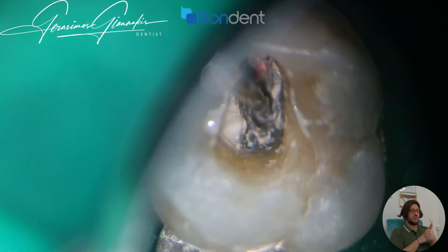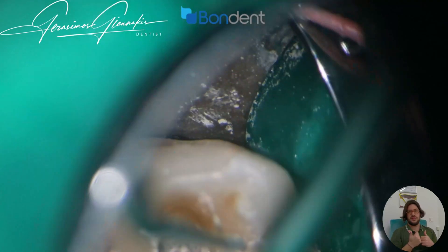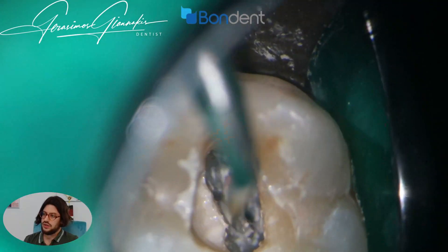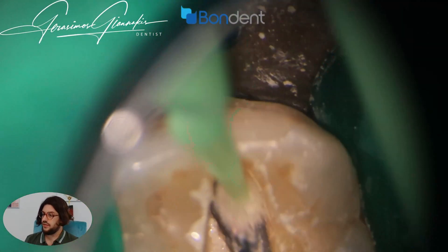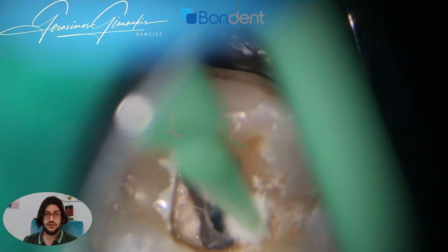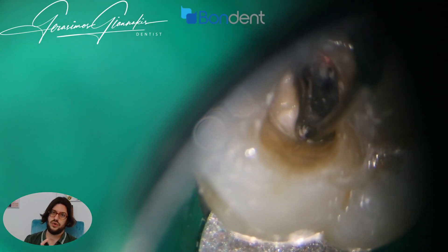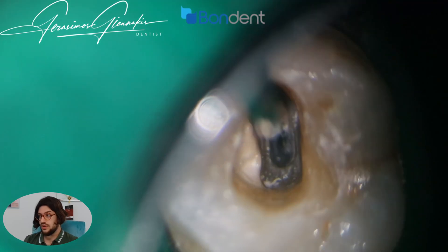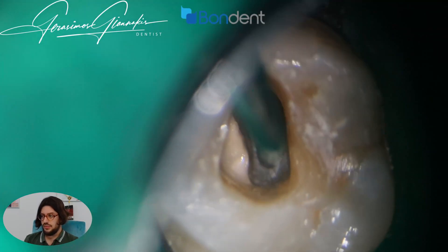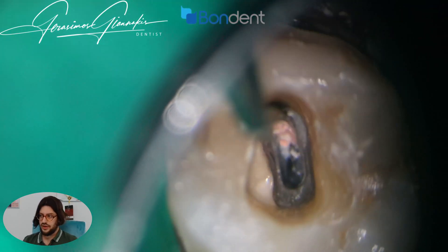Let's sum it up. First, evaluate the case from radiographic evaluation — periapical or CBCT. Then plan how to instrument such cases: do coronal enlargement on the orifices of the deep split canals. Magnification and illumination are very important factors. Ensure each file is entering the intended canal. For obturation, first obturate the most difficult to access canal and cut the gutta-percha in the orifice so no material blocks the other canal. If you have enough space, you could do both canals simultaneously.